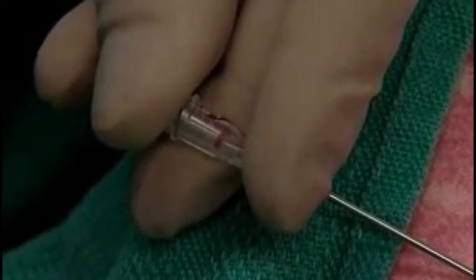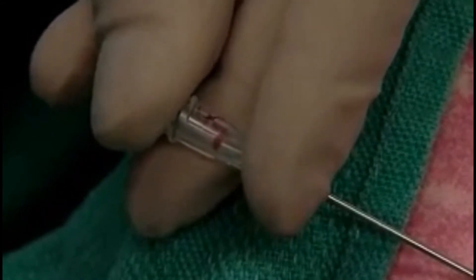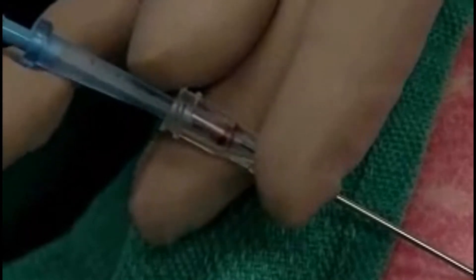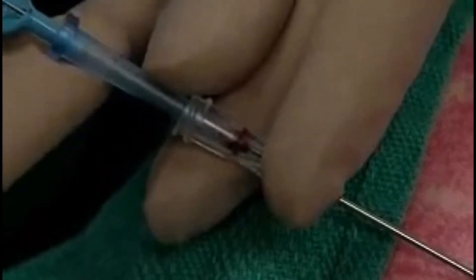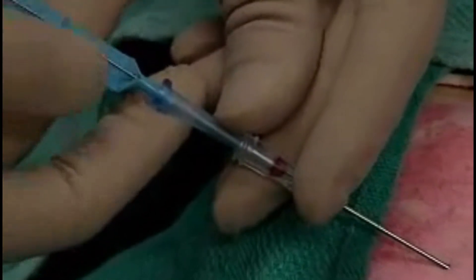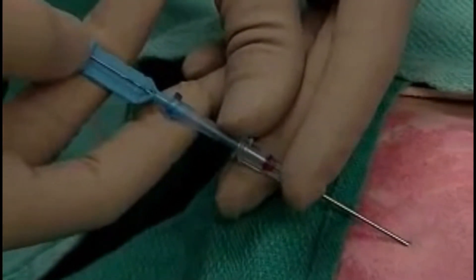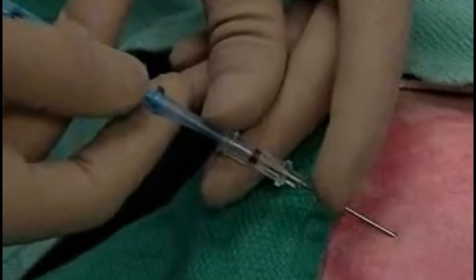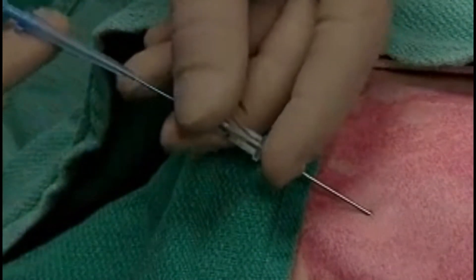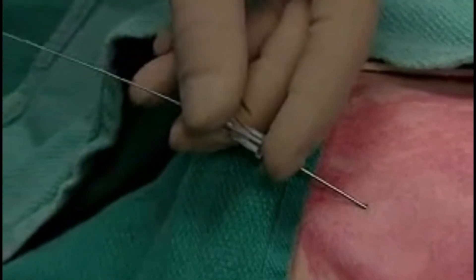Hold the needle securely and remove the syringe. Start feeding the wire — that 20 centimeter mark disappears into the needle, and we'll go just past that point. You can see the wire exposed.